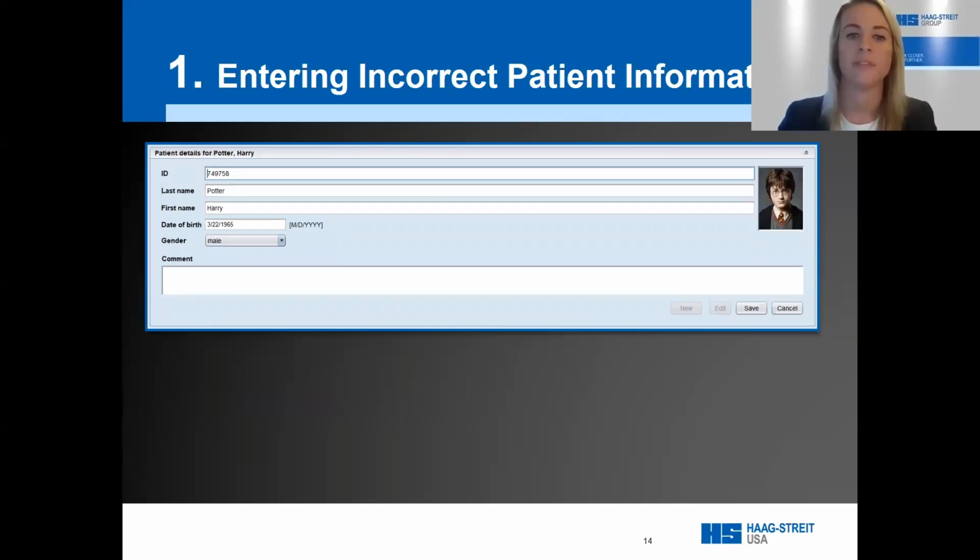Yes, identifiers are important for a lot of reasons, but to ensure the results of your field are as accurate as possible, the most important information you will be entering is the patient's birth date and their most recent refraction. But why? Let's start with the birth date.